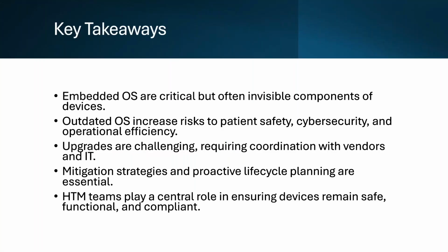Here are some key takeaways. To summarize, for HTM professionals, embedded operating systems are critical but often invisible components of devices. You may service devices for years without thinking about the underlying operating system, but it's there and it matters. Outdated operating systems increase risks to patient safety, cybersecurity, and operational efficiency. These aren't just IT problems. They're patient safety problems and operational problems that directly affect your work.